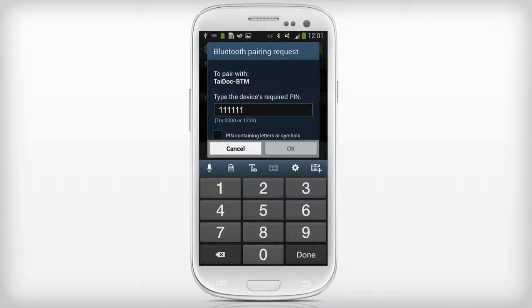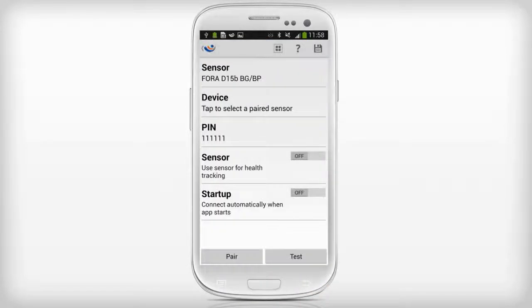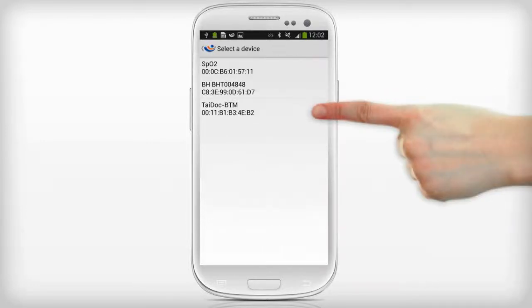The phone will now try to pair with the Fora monitor. When successfully paired, press the Back button on your phone. In the Sensor Configuration screen, select Device and select the TAIDOC-BTM from the list.